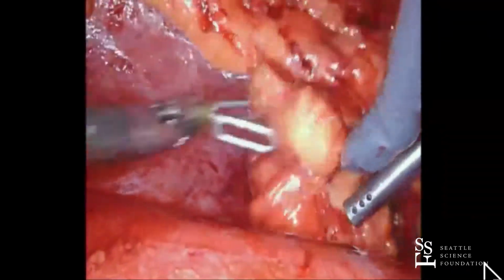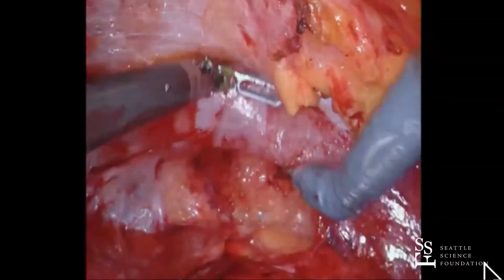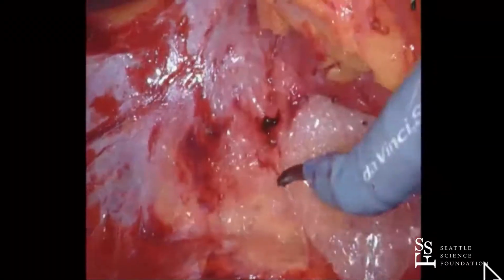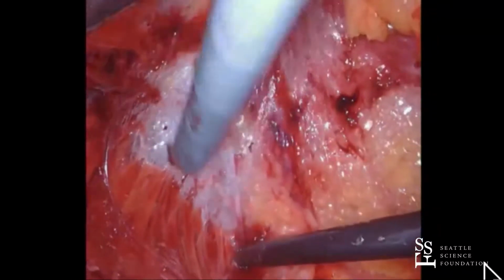So all I'm doing is just going to leave that down there. That's going to make our space a little better, okay? So I've already kind of entered it, but here's Gerota's. We call this entering the bag, so I'm just going to make this incision right here. Again, this is very safe. You stay right here, parallel to the psoas muscle. The other thing is I'm going to curve this up. So you see the body wall is like this.